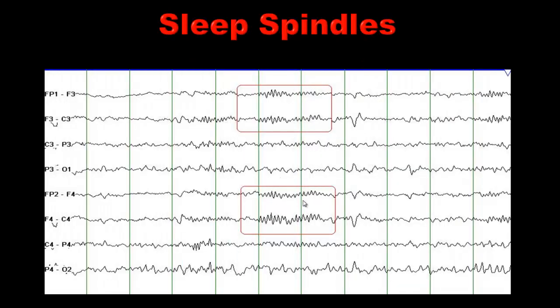Sleep spindles are normal — everything we looked at before was abnormal, but sleep spindles are normal. When you see these discharges, they are high-frequency, beta-to-alpha frequency discharges seen in the frontal-central head region, and they are diagnostic of stage 2 sleep. If you see sleep spindles, the patient is in stage 2 sleep. You also see vertex waves here — these are vertex waves and these are sleep spindles — confirming stage 2 sleep.